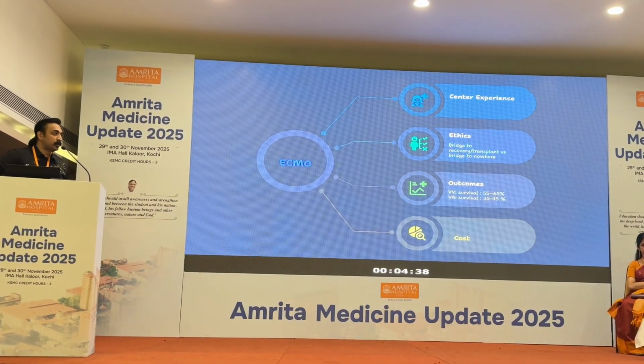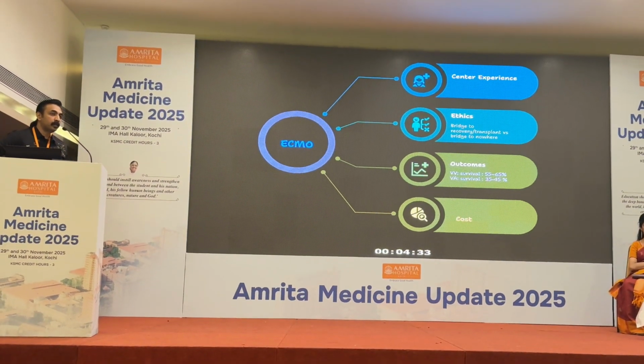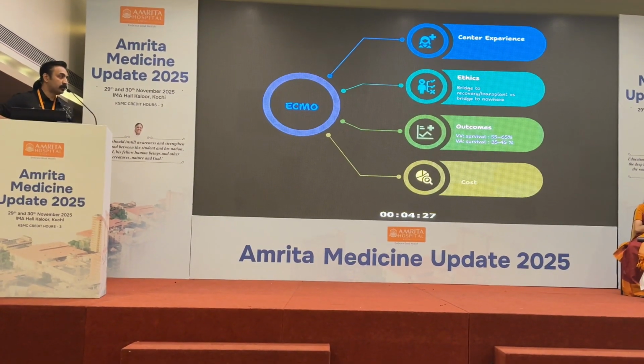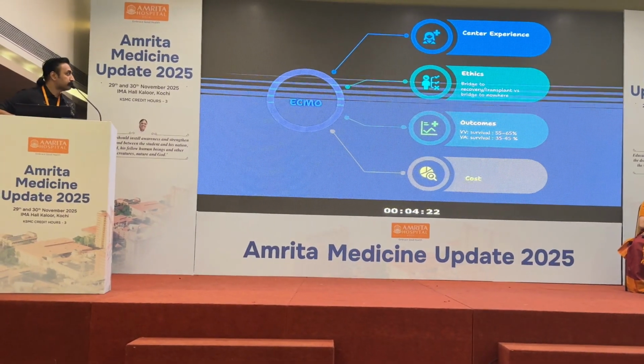The success of ECMO often depends upon the center's experience. The ethics part of it, always consider ECMO when you see some kind of an exit path. It's not that you put a patient on ECMO, it should be ideally a bridge to recovery or a transplant, or probably you're going to be stuck with the patient for quite long.